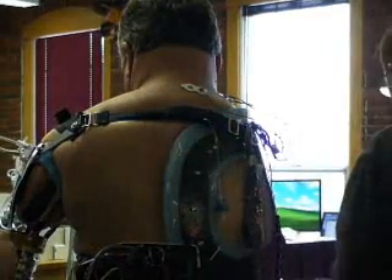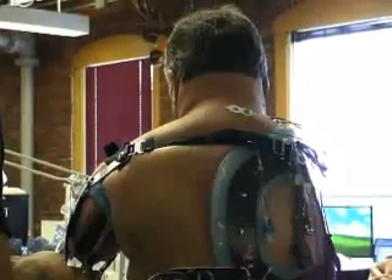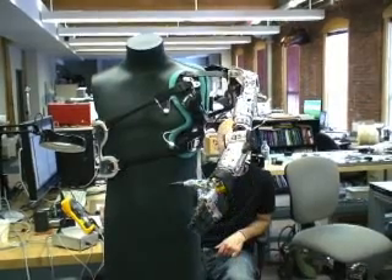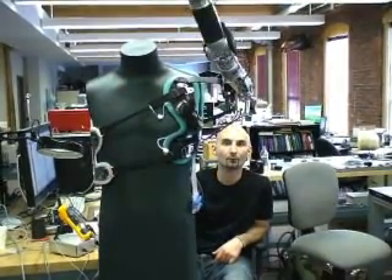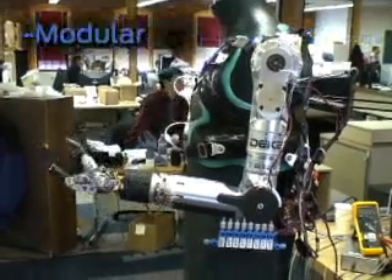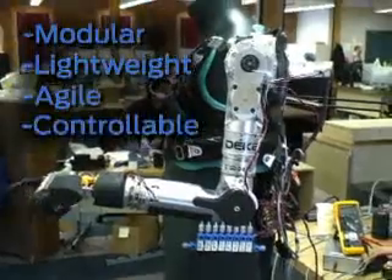Chuck Hildreth is one of several DECA test pilots — amputees who help Kamen's engineers optimize the Luke arm before it goes to official clinical trials. Kamen's team decided that the arm needed four main characteristics: it had to be modular, lightweight, agile, and it had to support customizable controls. The arm they've made is modular so they can actually take pieces of the arm to fit all three levels of amputee amputations.